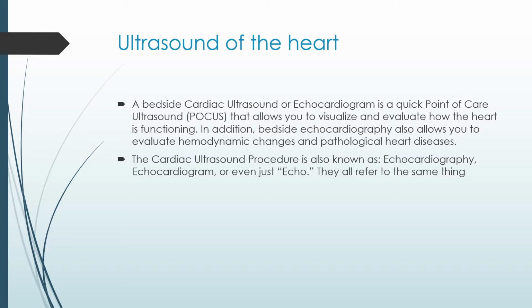In addition, bedside echocardiography also allows you to evaluate hemodynamic changes and pathological heart diseases. The cardiac ultrasound procedure is also known as echocardiography, echocardiogram, or even just as echo. They are referred to the same thing. Now, in addition to these things, you may also see cardiac ultrasound referred to as the transthoracic or transesophageal echocardiography.